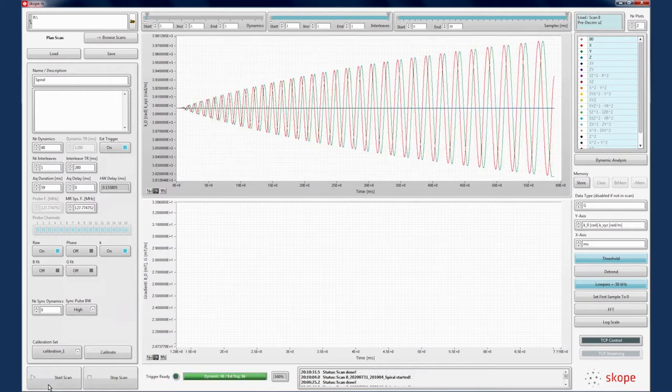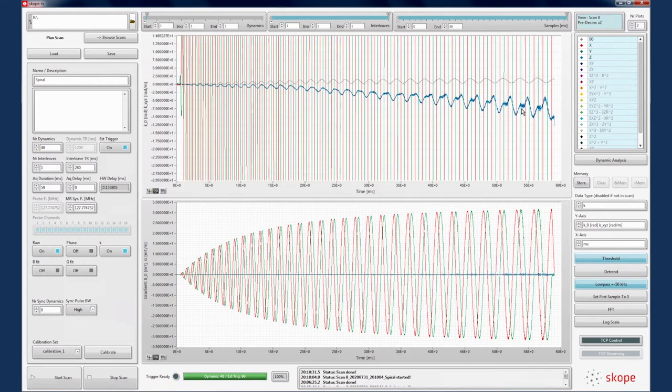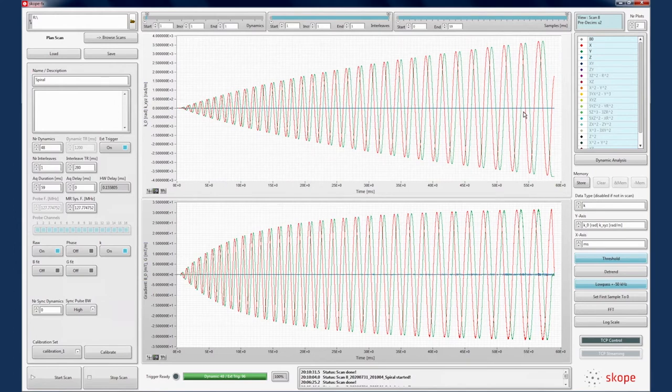Having acquired the spiral, we can see the measured k-space trajectory in the upper plot and the gradient waveform in the lower plot. If we zoom in, we can see unexpected effects in the z-gradient axis and the dynamic b0 term. Further, we can examine higher order field components.